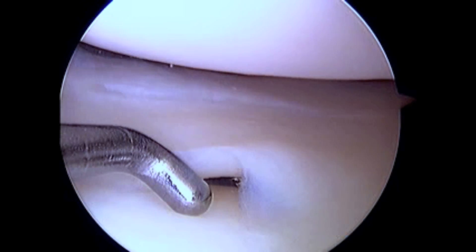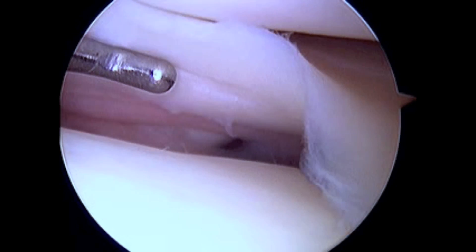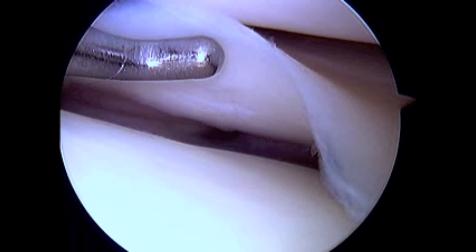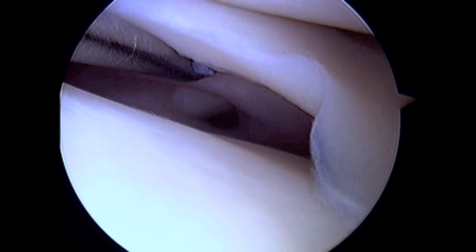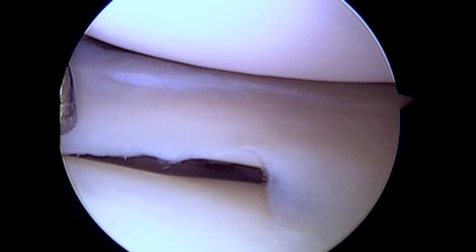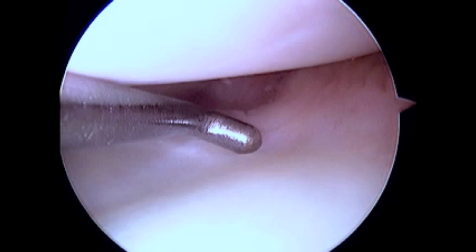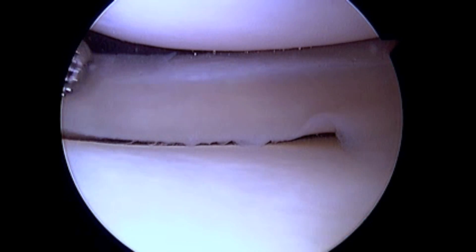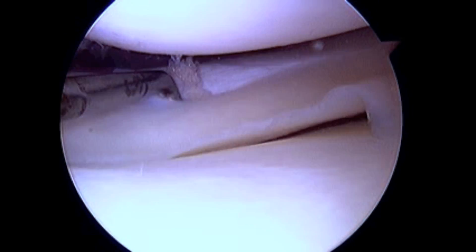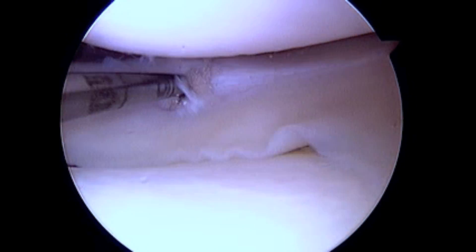When one probes the undersurface of the meniscus, you can see there is a full substance, complete meniscal tear. Debridement of the free edges of the meniscus tear with an arthroscopic meniscal rasp is essential to stimulate a vascular healing response and maximize one's biologic healing potential.